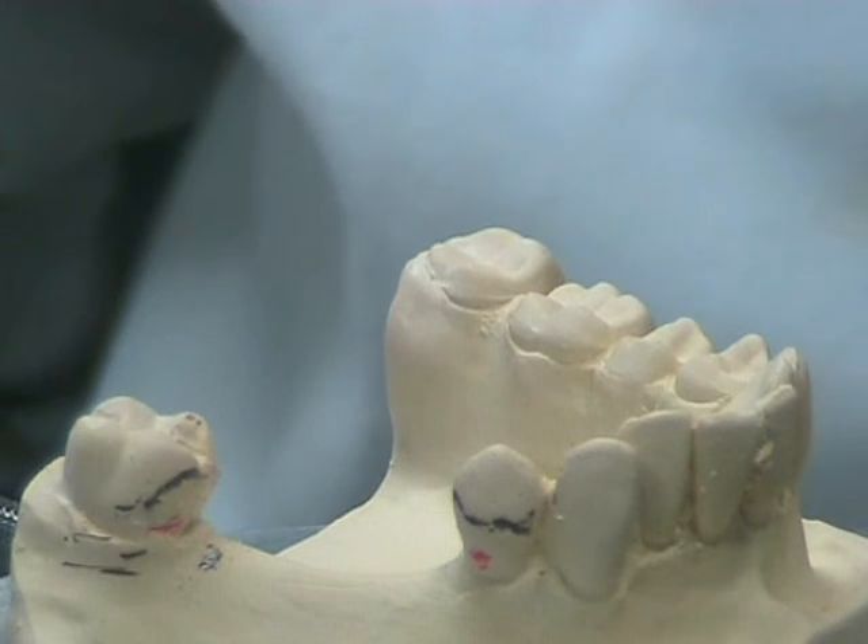As you can see, the undercut marking is in the undercut region.